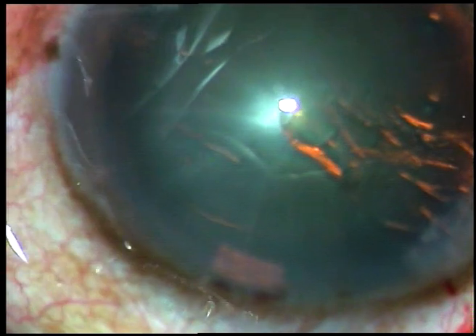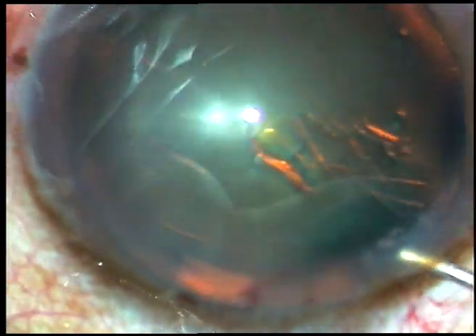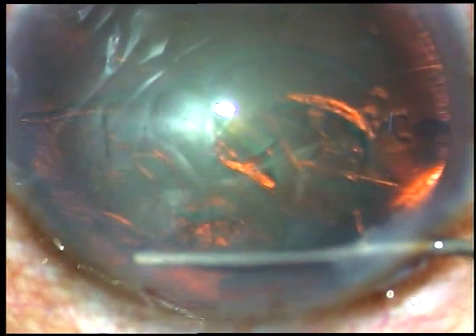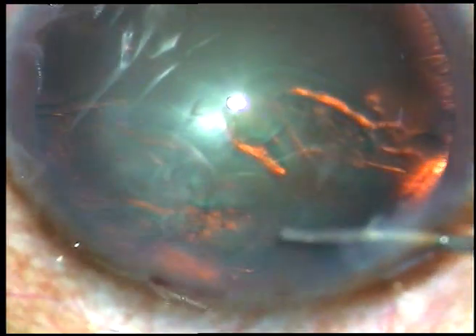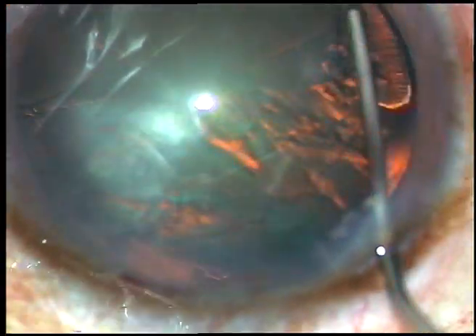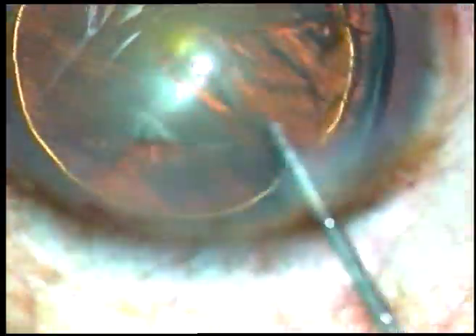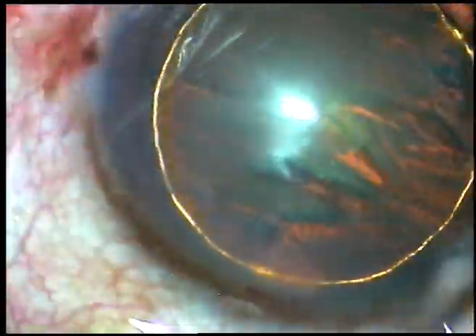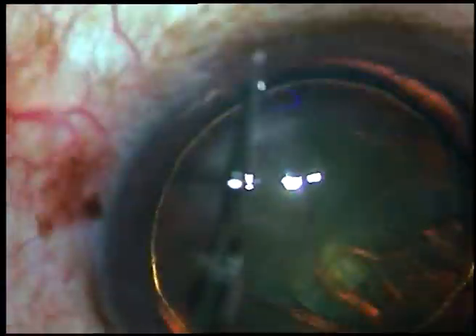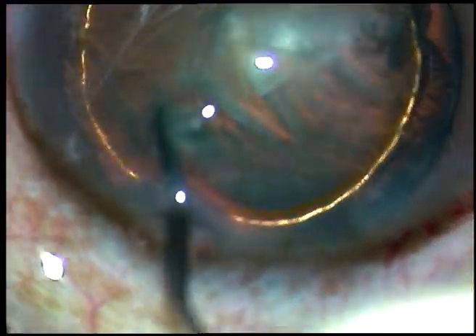Now hydrodissection is done. The fluid wave is passed from one side and it travels to the other side. In this case, hydrodelineation is also done and it has produced a beautiful golden ring.